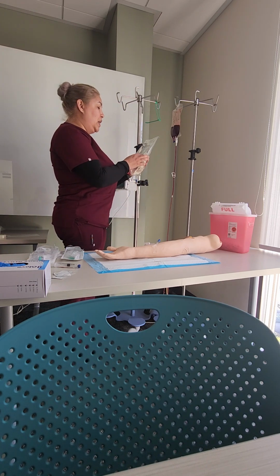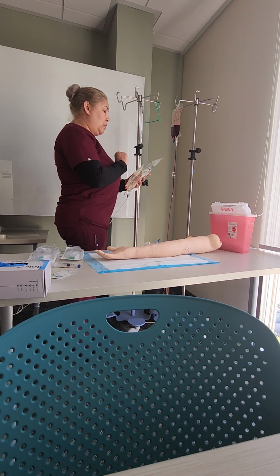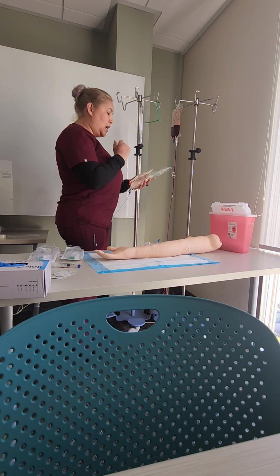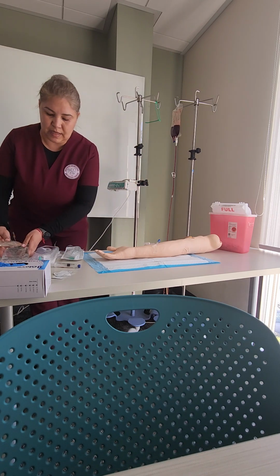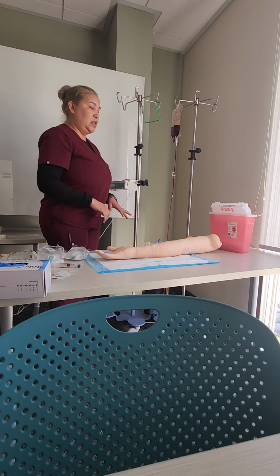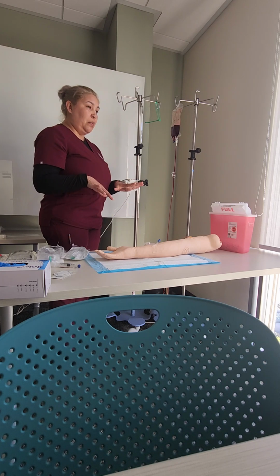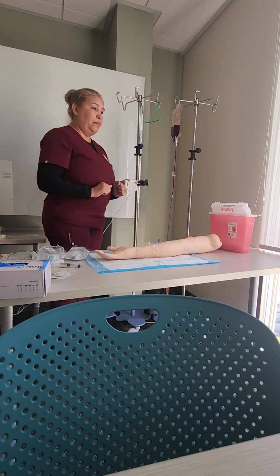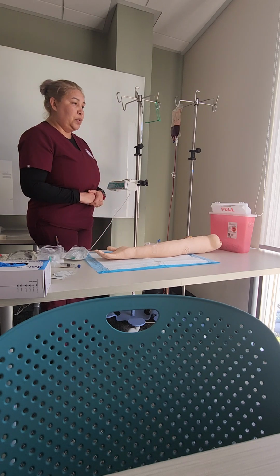And now what I want to do is scan my bags. So scan my hydration solution, which is sodium chloride. I want to scan my antibiotic. They are set to go. I will set that aside. And what I want to do now is, my usual, I will raise the bed up to a position where I'm going to be working, lower the rail, make sure that the bed is locked, and make sure that my patient is comfortable.